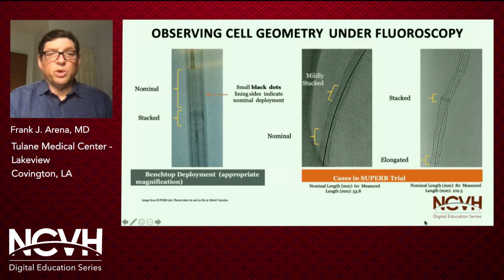So when we talk about nominal deployment, this is not the kind of stent that you can just put in and then post-dilate. You'll get a very poor result if you do that. You really need to pre-dilate very aggressively. Often the company will tell you to use a millimeter larger balloon and go to nominal size, and then have a long inflation, maybe a minute or so. Some people, including myself, often will use the same size balloon at high atmospheres, 15 or above, again for a fairly long inflation. And then when you place the stent, you want to do it on high mag.